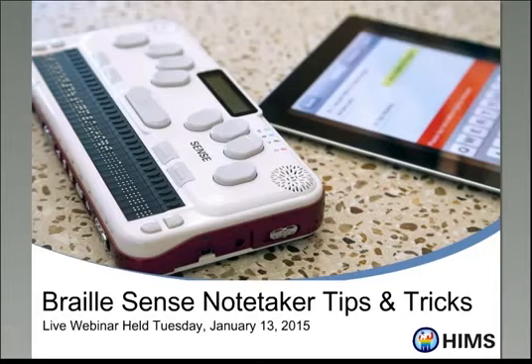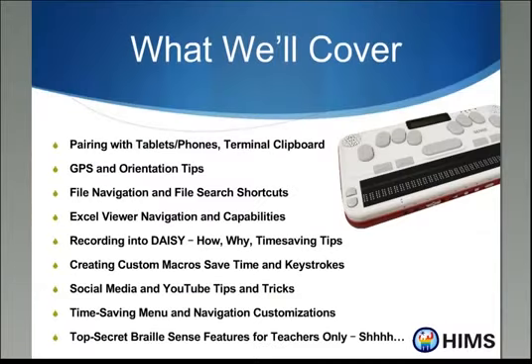We're going to be doing one of my favorite things, which is basically just playing with the BrailleSense and making it do different things that sometimes people overlook in the grand scheme of things. So we were just trying to find some sort of tips and tricks that people miss sometimes so that we can try to make your lives a bit easier. Let me pull up the PowerPoint on my end, and I guess we'll get started.